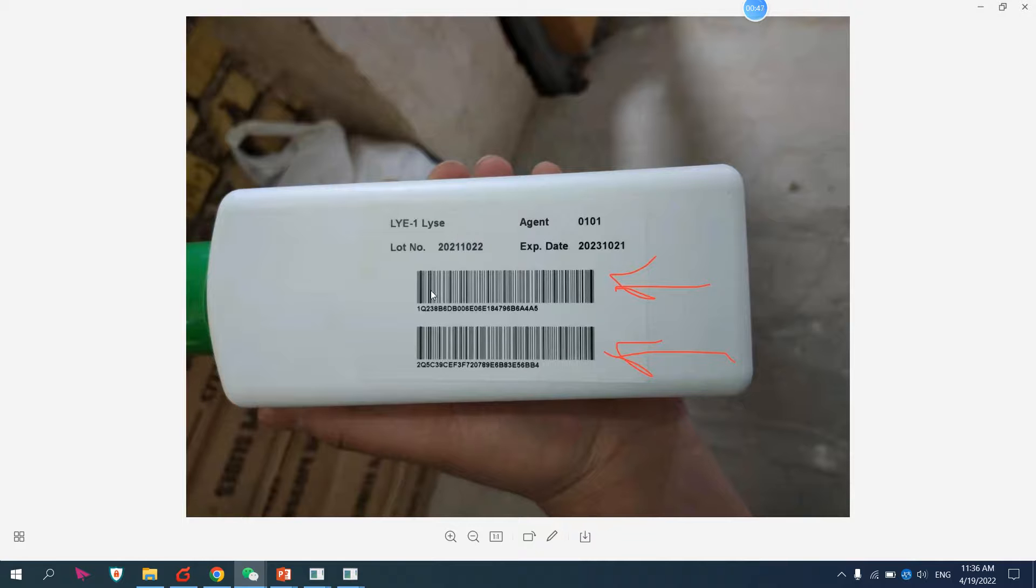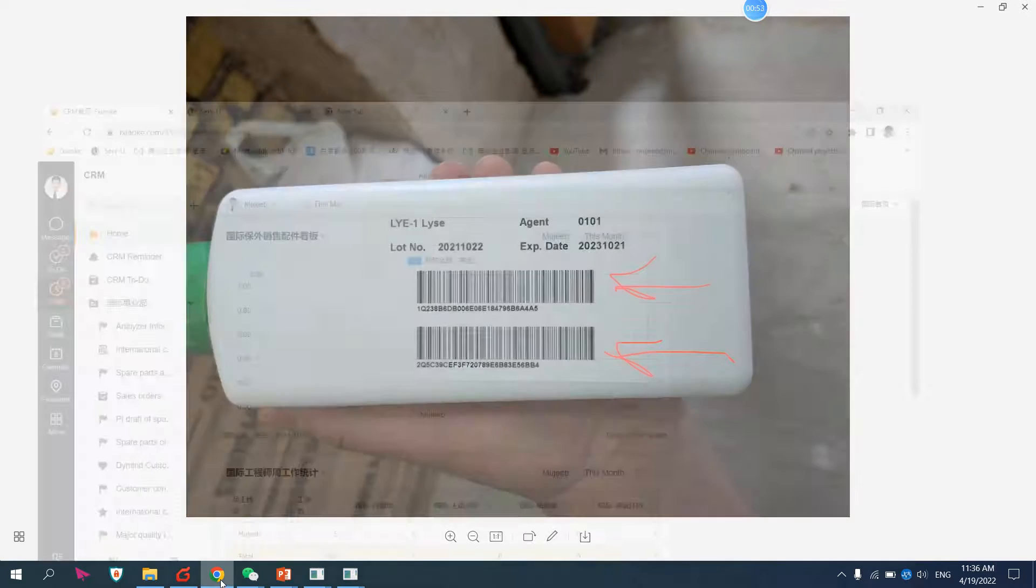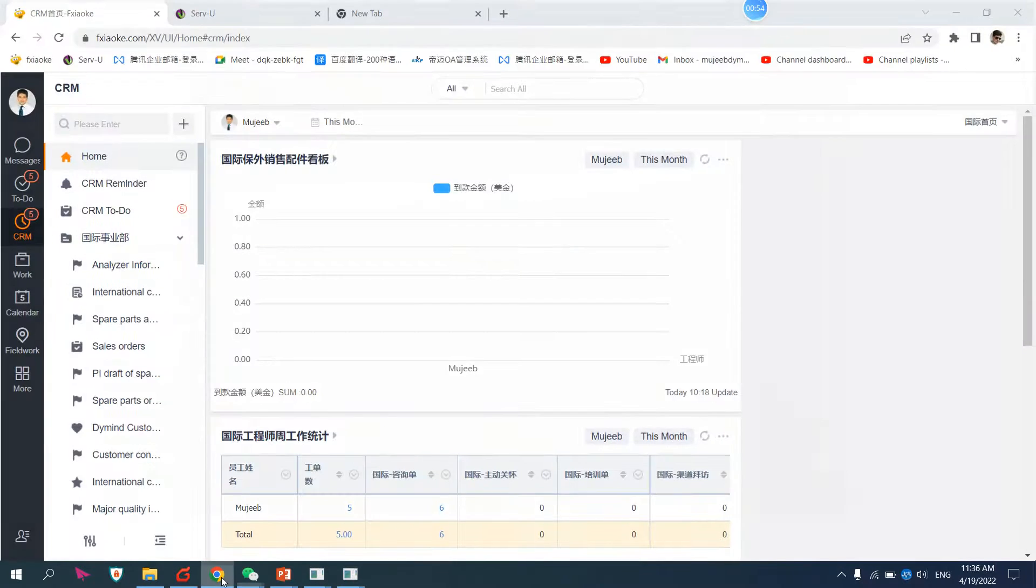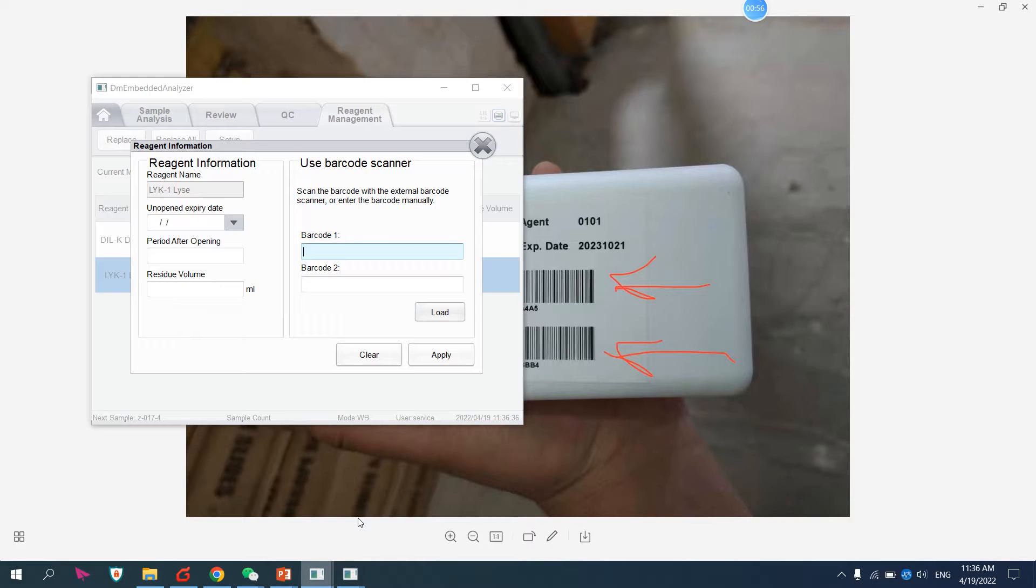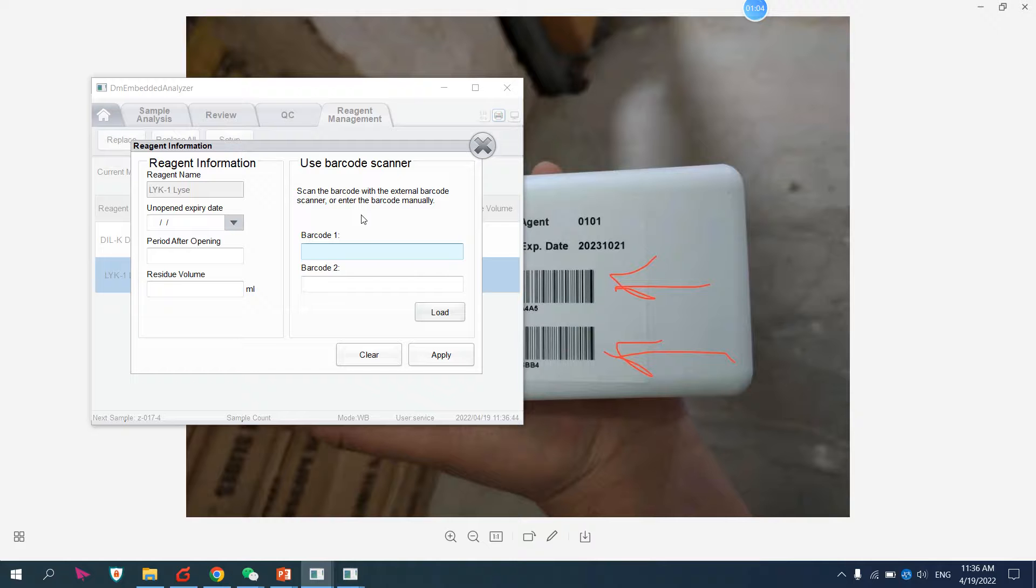Barcode 1 will start with 1, barcode 2 will start with 2. If we have external barcode scanner, let me show you how to scan the barcode with an external barcode scanner. If you have one, you can scan directly here. It will automatically input, and you can also do it manually.